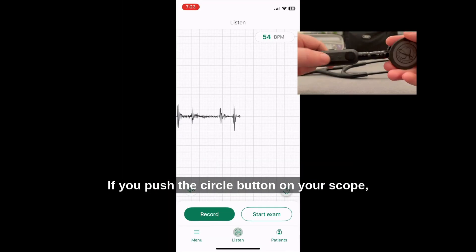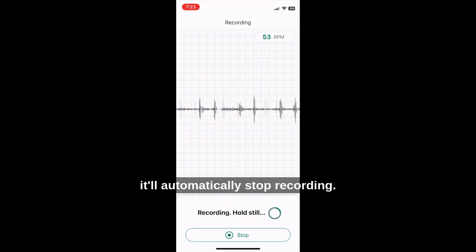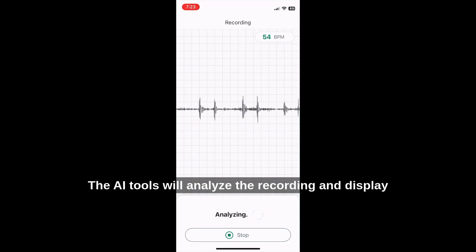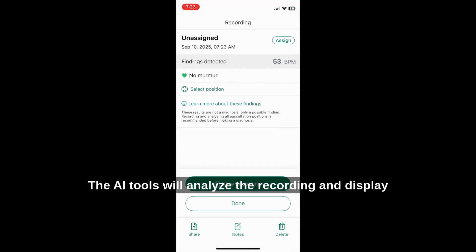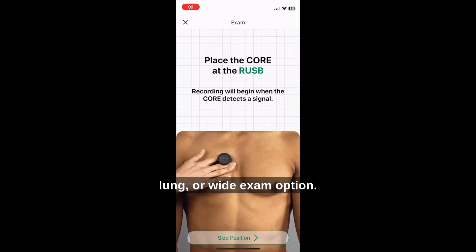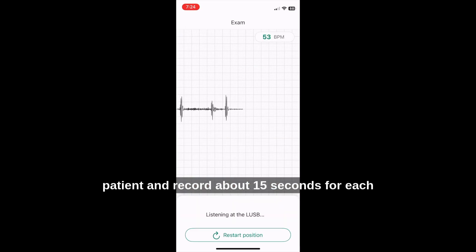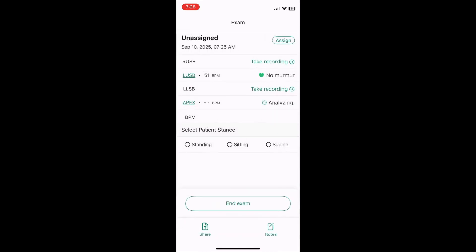If you push the circle button on your scope, it will begin a recording. Then after 15 seconds or so, it'll automatically stop recording. The AI tools will analyze the recording and display some basic info like heart rate, and flag any potential murmurs that were detected. You can also select a guided cardiac, lung, or wide exam option. The app will give you prompts for scope positioning on the patient and record about 15 seconds for each position.